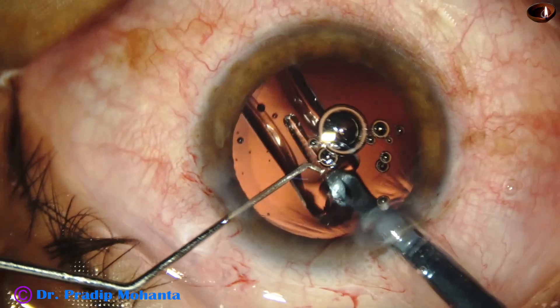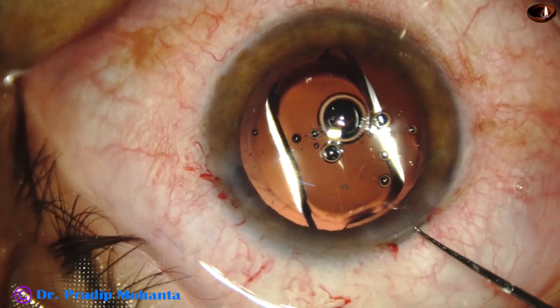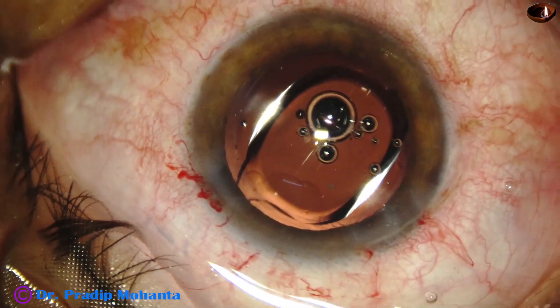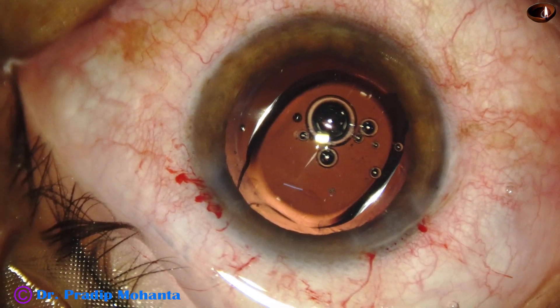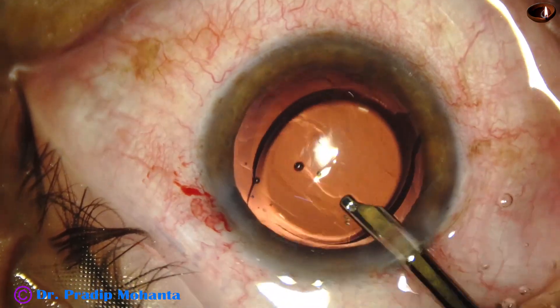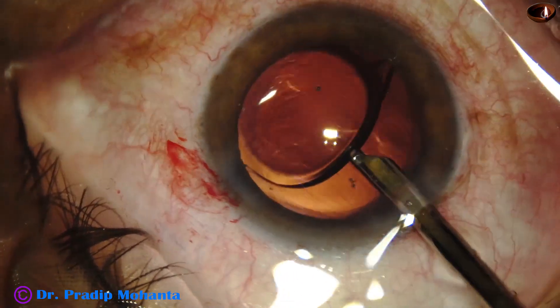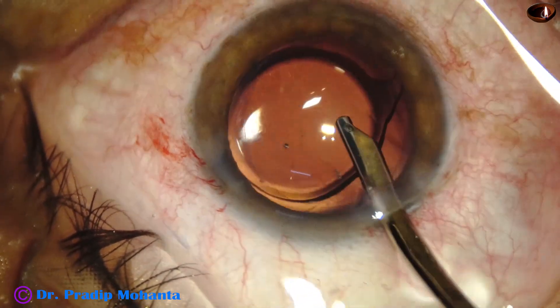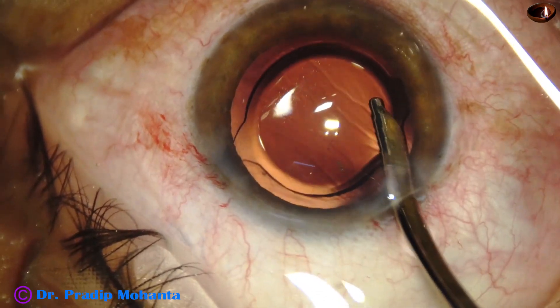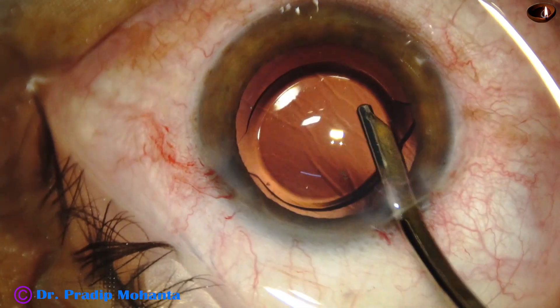The haptic goes into the bag. Both the haptics go into the capsular bag, and the haptics conform to the equator of the capsular bag. And now, the viscoelastic substance used for implantation of the intraocular lens is being removed.